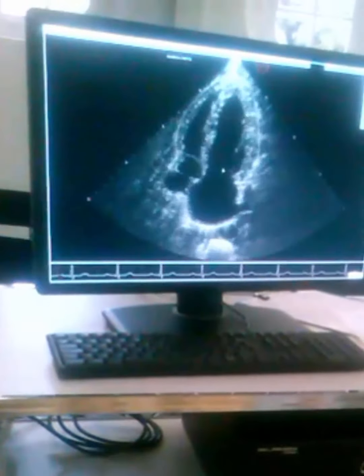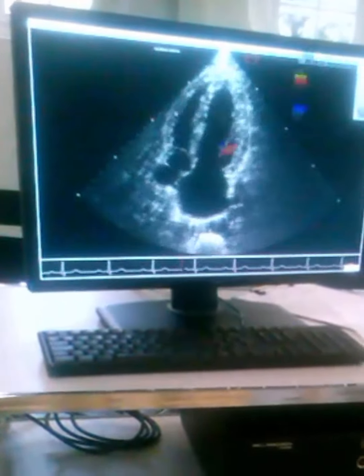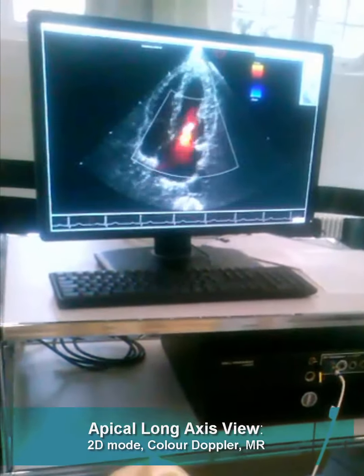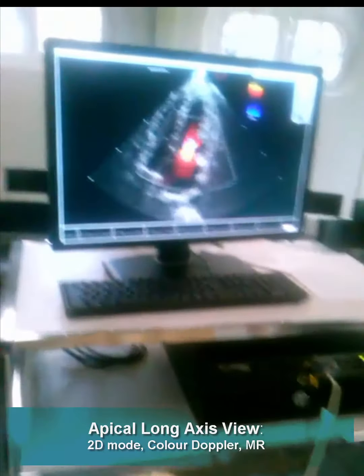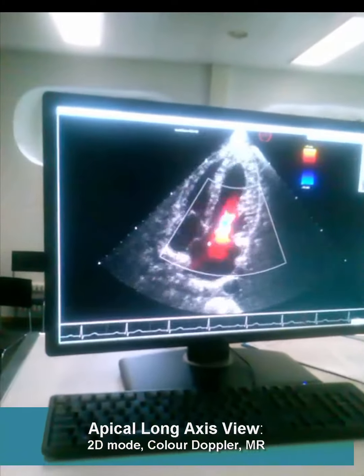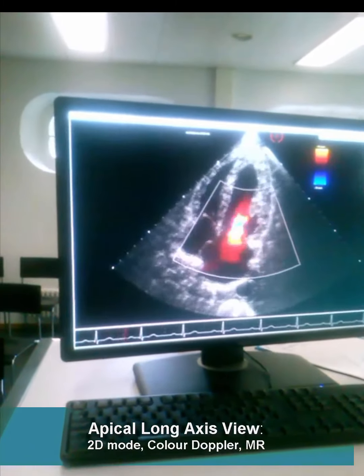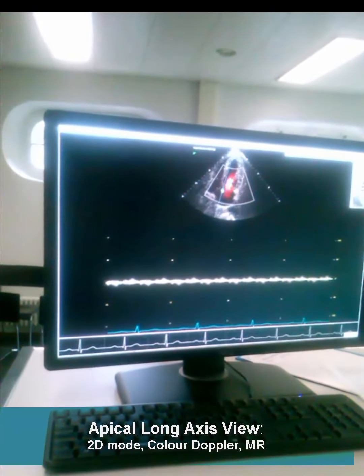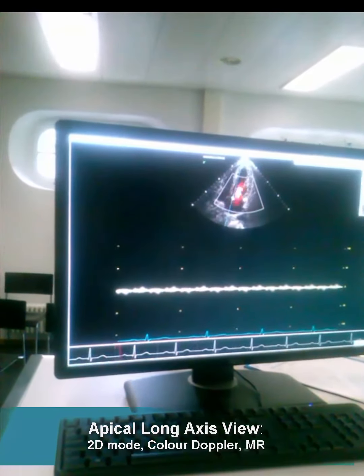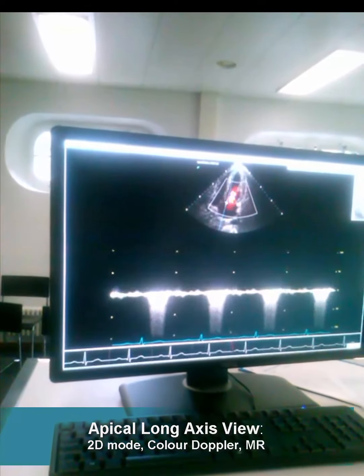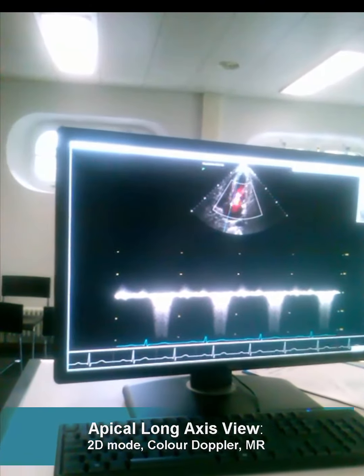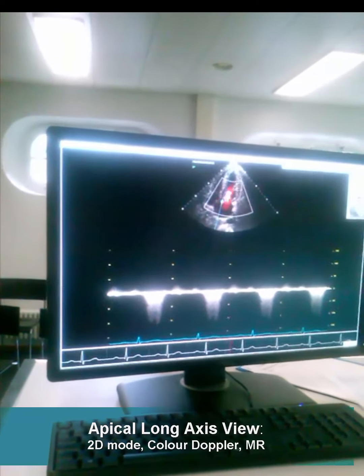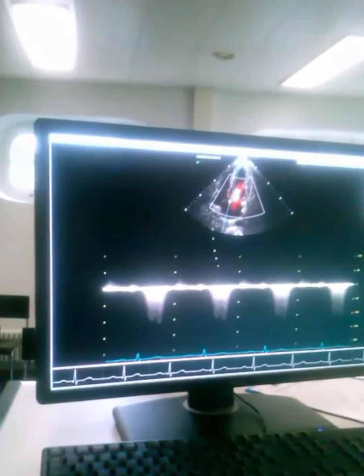This is the mitral valve — you can put the color Doppler on. You can see now mitral regurgitation, eccentric and severe. We can take the color wave Doppler, continuous wave. As you see now, there is severe regurgitation.